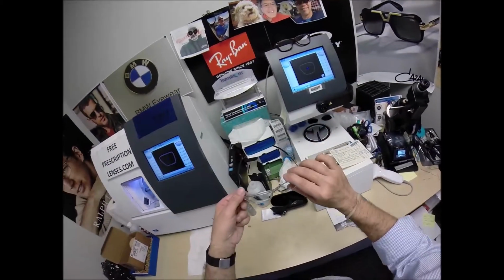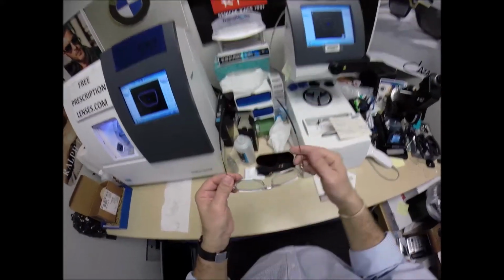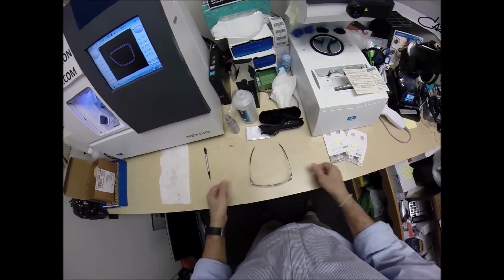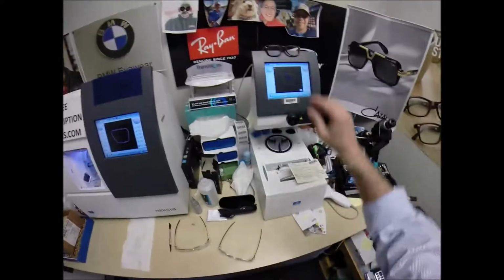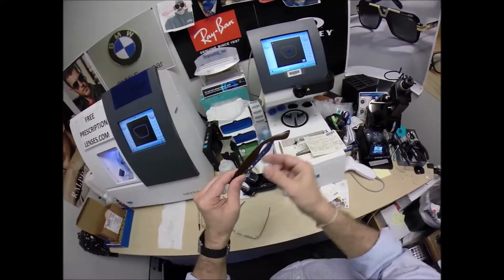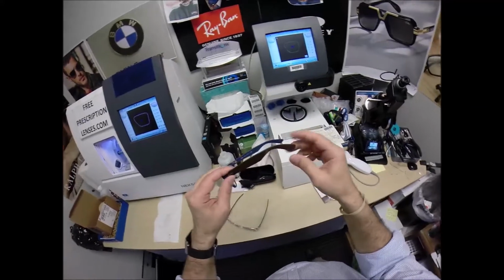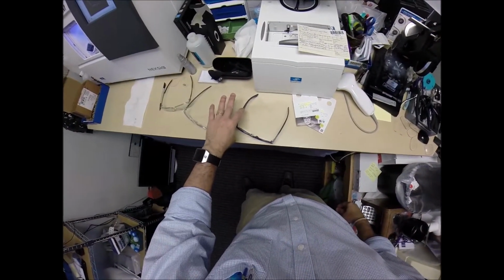It only takes about 30 seconds to a minute to adjust a pair of glasses perfectly. But I'm going to get them in standard alignment, also known as a 3-point stance. The 3 points are 1, 2, and the bottom of the frame being 3. I set it on the counter and press down. There is no wobble. Now, when I say wobble, of course, those don't do it either. These have pilot temples, which I'll show you, but these are spatula temples. You can imagine where it looks like a spatula there. And I want to take my Ray-Bans off and press down on the counter. They wobble on the counter, but they sit level on me.